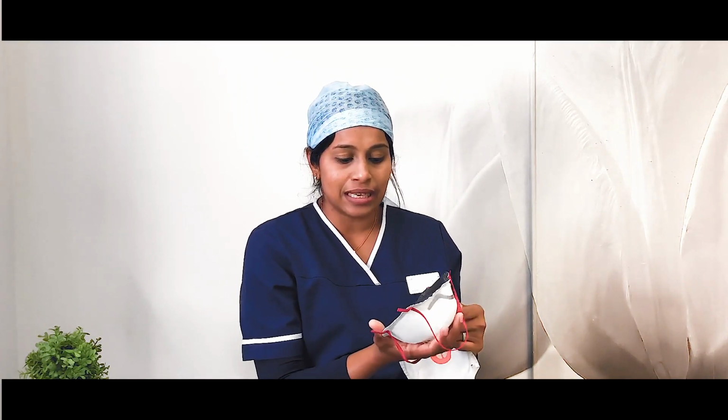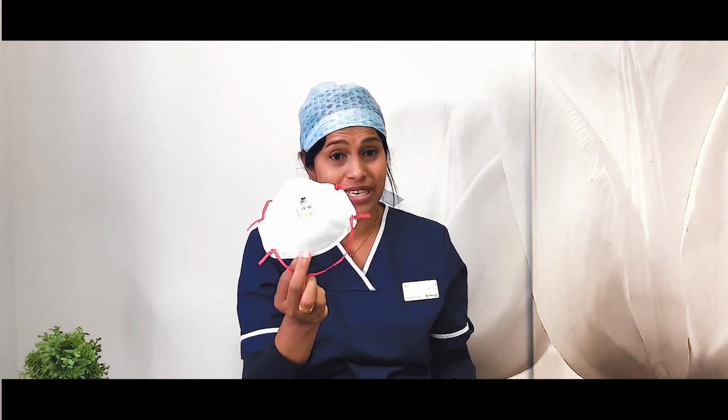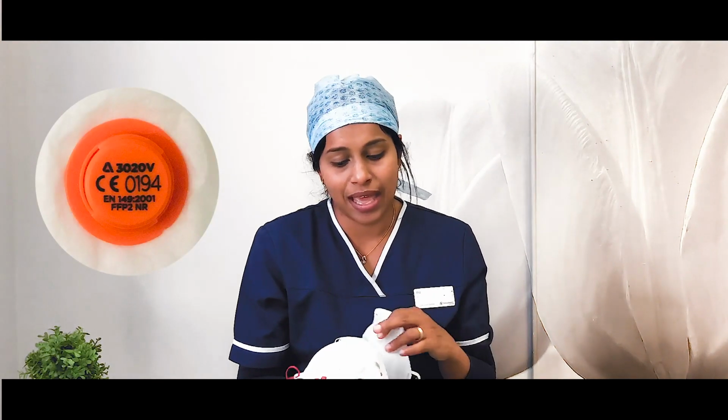Again, the FFP2s come with quite a good seal with these ones, and I actually fit tested positive with these FFP2s, this particular brand. Yes, but they do come with all the markings, the EN markings, and so this as well comes with all the EN markings, or it will be the NIOSH markings if it's in the American guidelines.